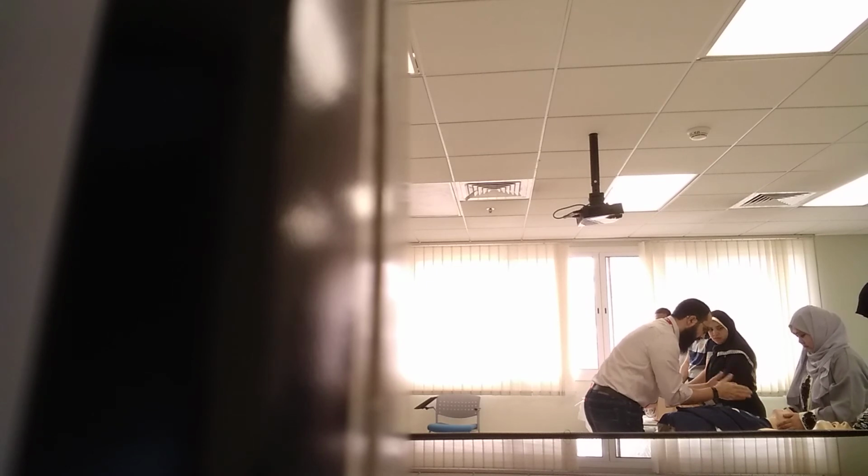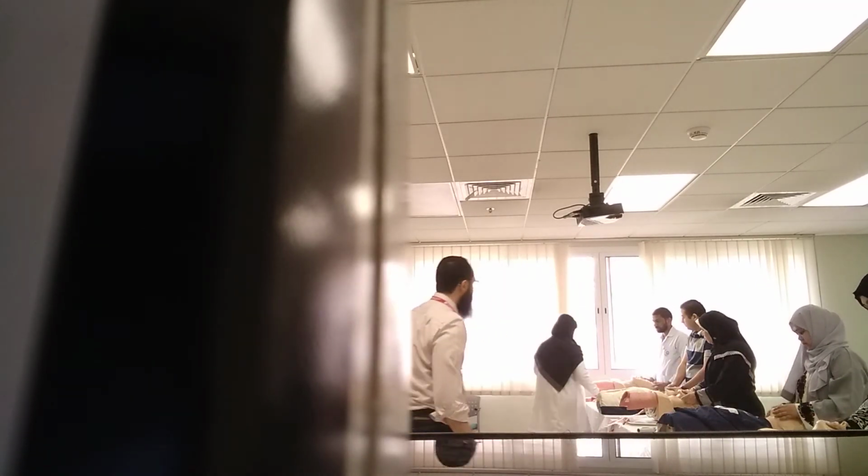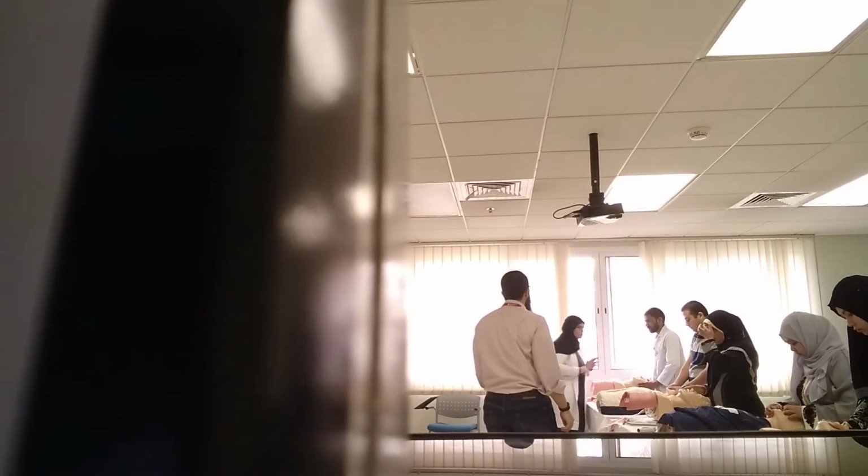Do it like that. No, don't move the head, for this patient with spine injury. If you move the head, exactly like that. Yeah. Don't move the head; move the jaw forward and open the mouth. Okay. So this is it, for this patient with spine injury.